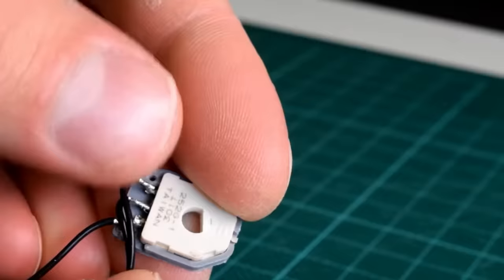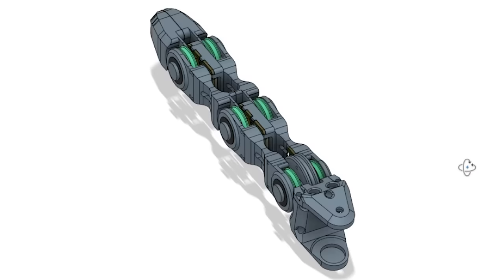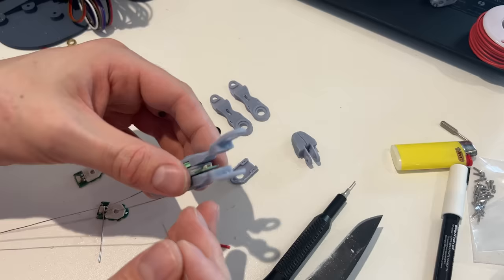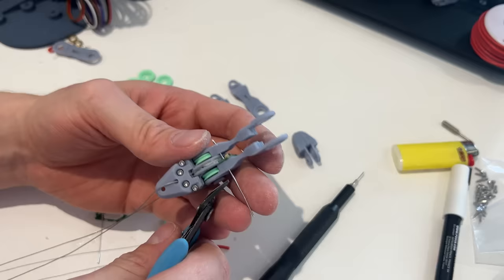The board also forms part of the structure of the finger, further reducing part count, complexity, and assembly time. I did consider replacing the wired connection system with snap fits but for now I feel confident with the wired method.